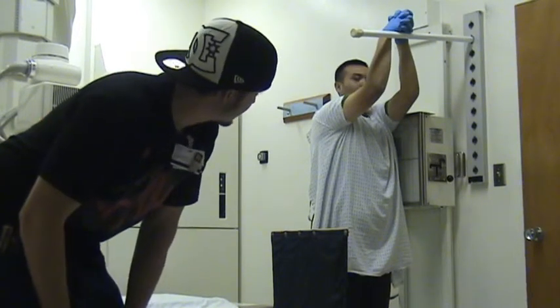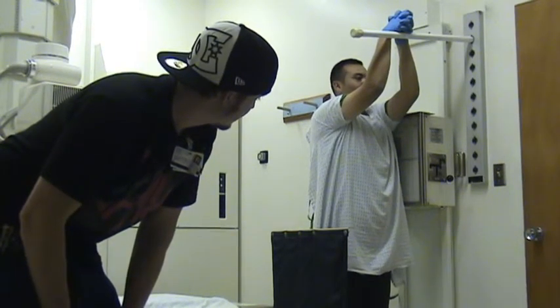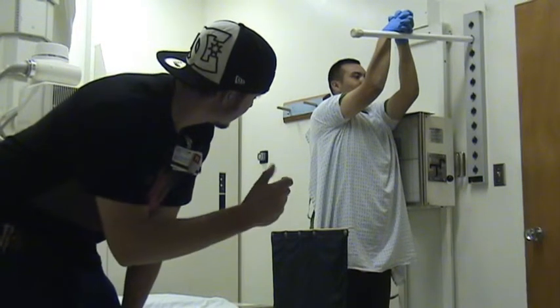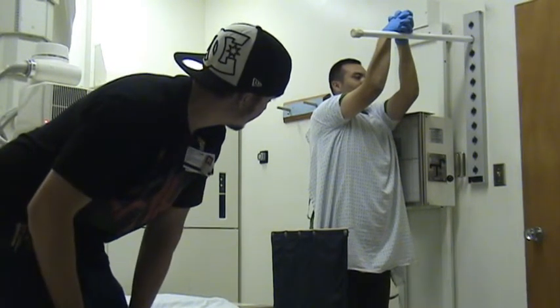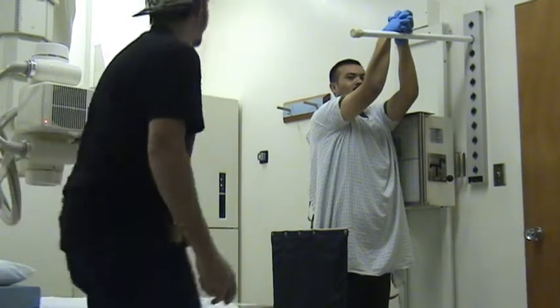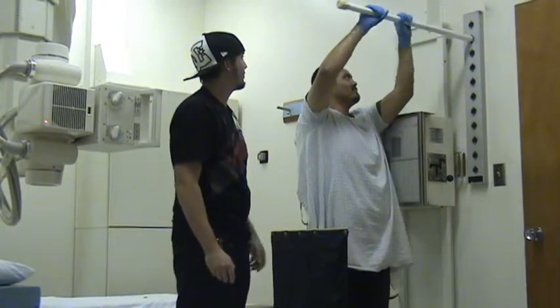Sir, go ahead and take in a deep breath. Let it all out. Go ahead and take in another deep breath. Hold it. Click. And breathe. Always make sure that you tell them to breathe afterwards. Alright, and that's it. Go ahead and relax, sir. You did a good job.